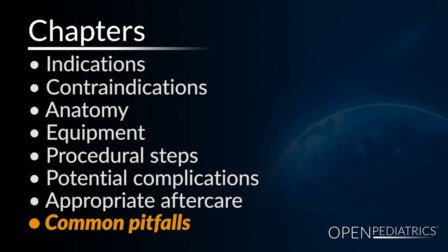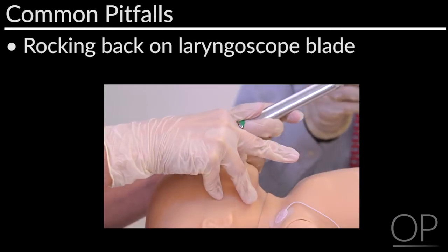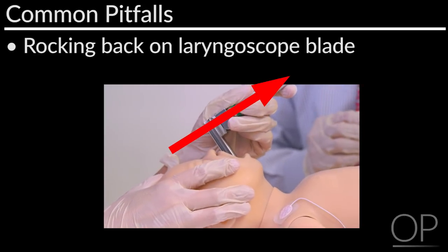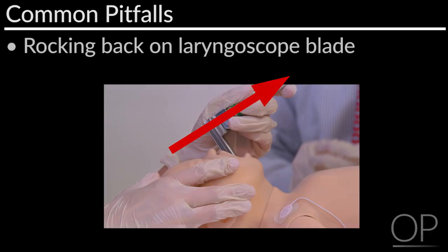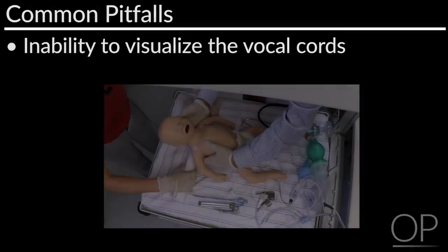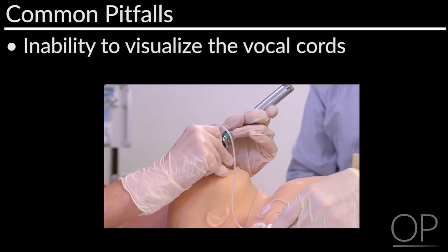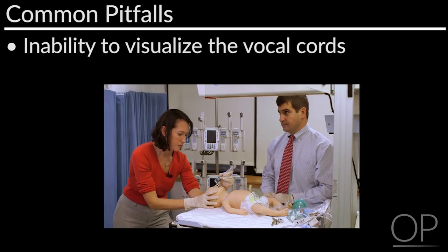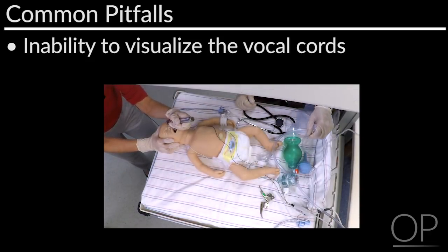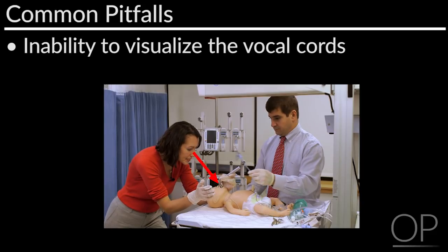Common Pitfalls. Common issues encountered during tracheal intubation include rocking back on the laryngoscope blade. To avoid this, the provider should concentrate on lifting and not rocking the laryngoscope to obtain a view of the vocal cords. To assist with inability to visualize the vocal cords, the provider should ensure proper positioning of the patient, adequate suctioning, and proper alignment of the provider's body and head in relation to the patient's larynx. The chest of the intubator should be aligned with the patient's head, and a straight line should be obtained between the intubator's eyes and the patient's vocal cords.